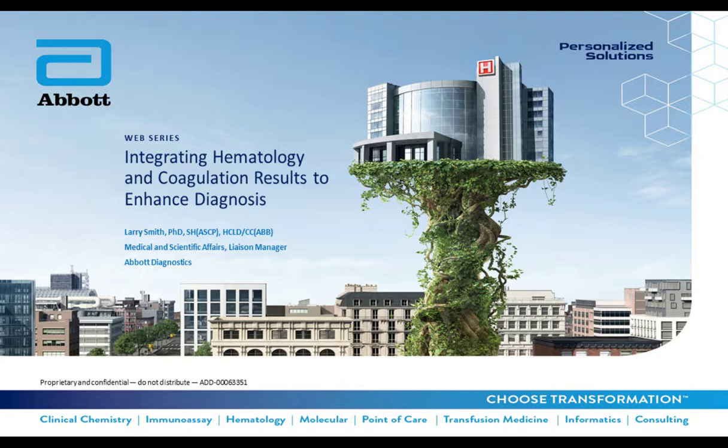The routine coagulation tests are really very simple, very cheap, and they do offer a lot of information concerning the overall picture. The routine assays that we do for patients with DIC, we need to show that there is this consumption that's occurring. So the routine PT and APTT would be prolonged, and that would be suggestive of consumption. The decrease in the fibrinogen would go along with this very same pattern. So those are really very, very good.